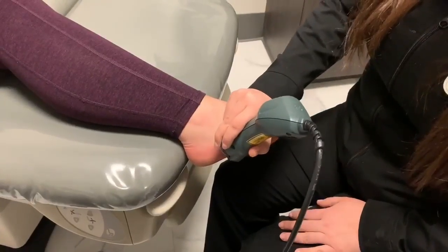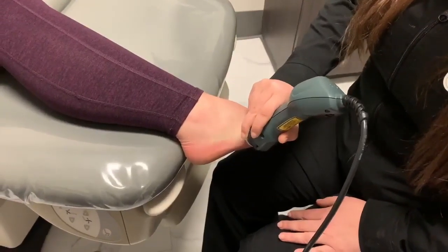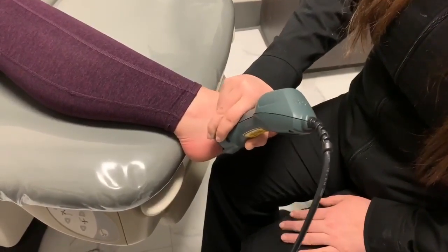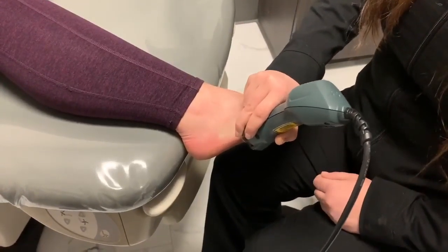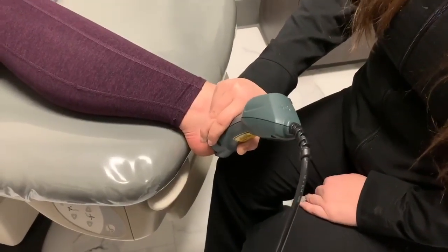This is your second treatment. What did you feel after your first one — the next day or later that evening? Did you feel any coldness or tingling, or did you get sore afterwards? Not sore, more of a tingling. I have had patients say before, especially with nerve issues, that when they walk out of here they felt a cooling sensation and a big difference in their foot.